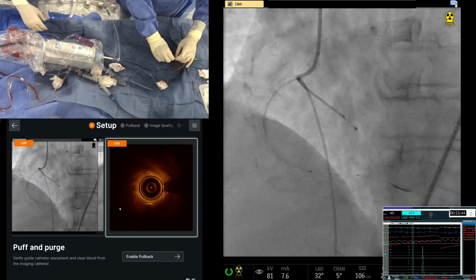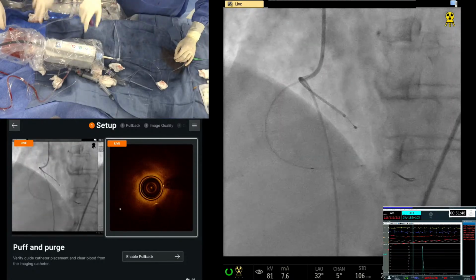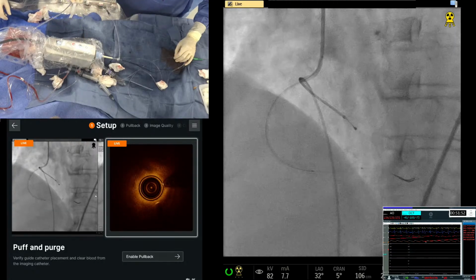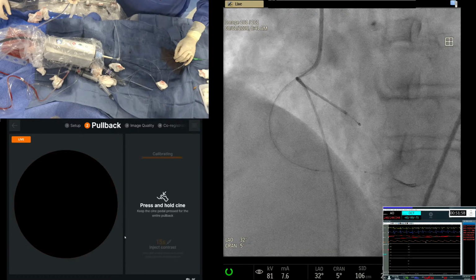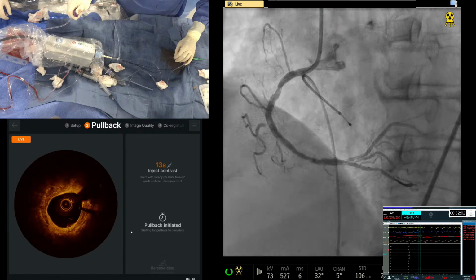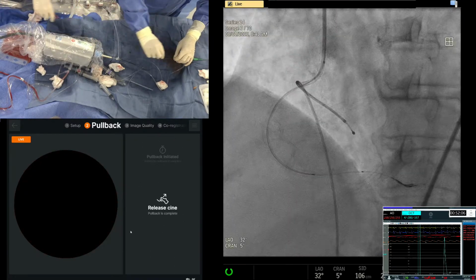Great clearance. So we are ready. The setting is good. You want to go, right? Start doing this. I'm going to do enable. Yep, you do it. Okay. Enable, one second. Enabling. One second. Calibrating. Yeah, seen it. Inject. Yep. Oh, beautiful. You got a beautiful image.